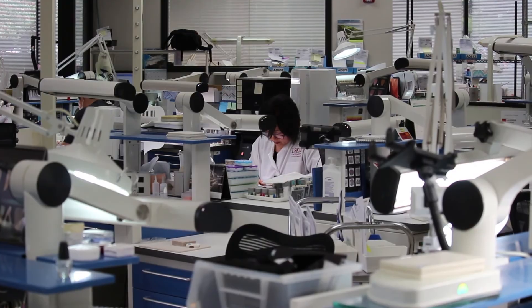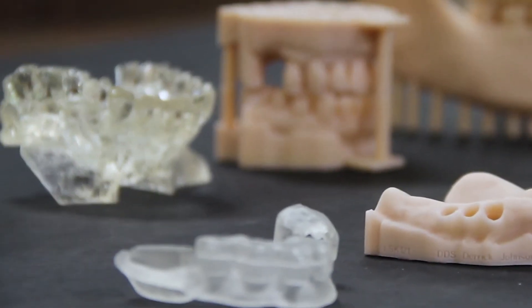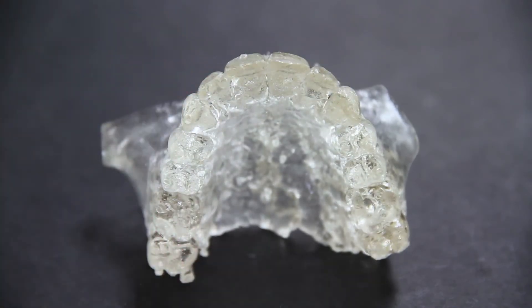LSK 121 is a dental laboratory. We fabricate crown and bridge, implants, denture, and some of the ortho stuff. We fabricate everything in-house.